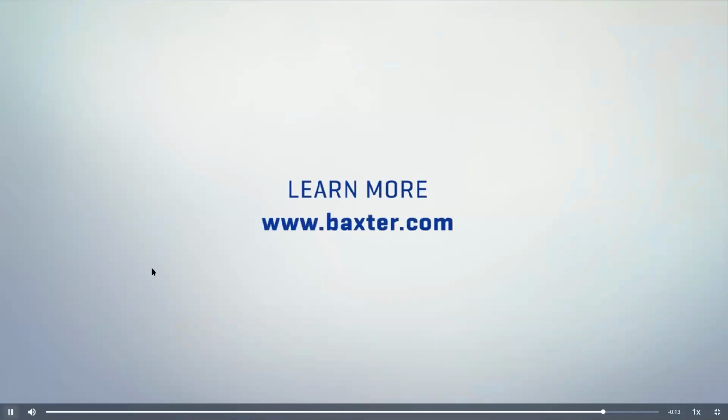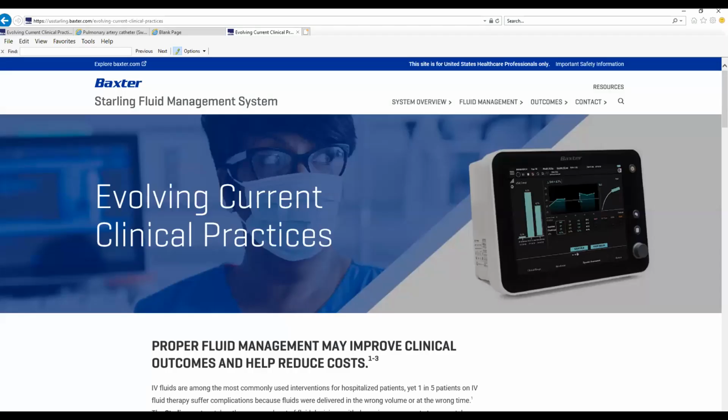All right, so take a look at that video when you have the opportunity. There was a question: how long is the passive leg raise performed over to see the percentage change? Oh, it's not long. So minutes? I always thought it was pretty much over 2 minutes. That's what sticks out in my mind about a 2-minute test.